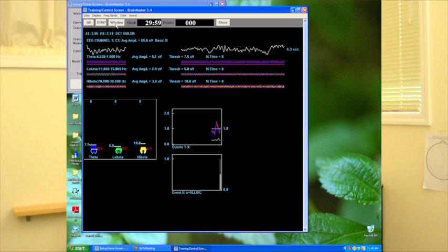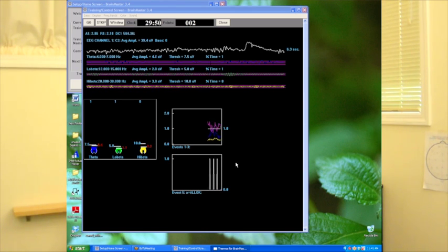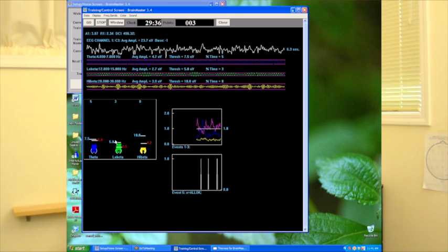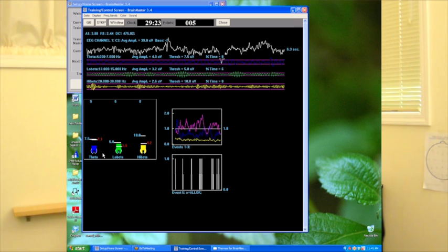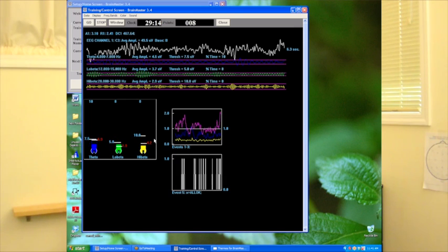I'm going to start off by checking to see what all my parameters are — they all look good to me. I'm going to start it up and give him something to view. What we have here is we're asking him to lower the theta below 7.5 microvolts, to increase his low beta or SMR above 5 microvolts, and to keep the high beta down, which is the muscle artifact. He's in good shape with that, so I'm not really concerned about it. I'm going to say: keep your theta down and your SMR up, and every time you do that you'll gain a point.